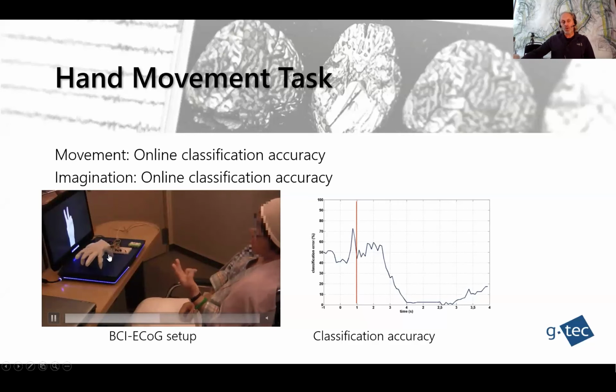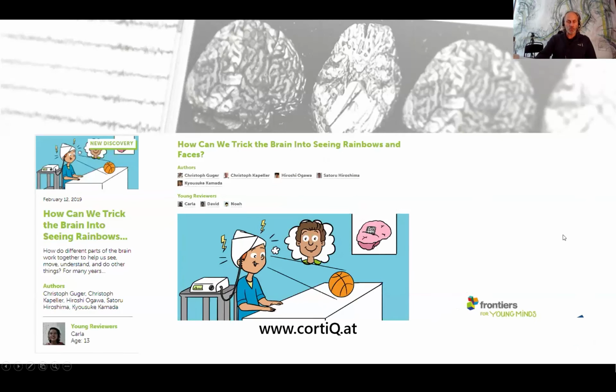This is actually perfect embodiment that we want to achieve with the brain-computer interface. So the robotic system should really do what the brain suggests. But this shows also that patients are sometimes making mistakes. And that's the reason why you cannot always expect a brain-computer interface to deliver 100% accuracy. But we want to have, of course, perfect embodiment for robotic system control.